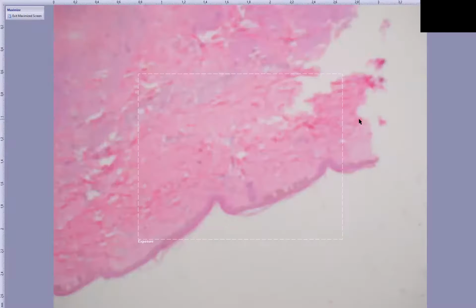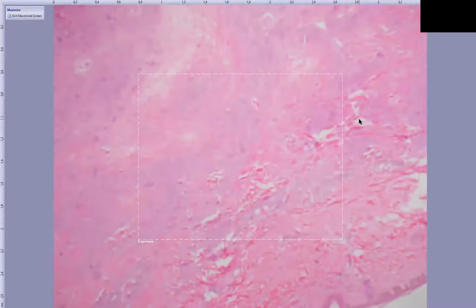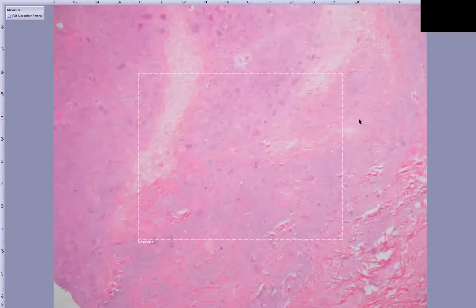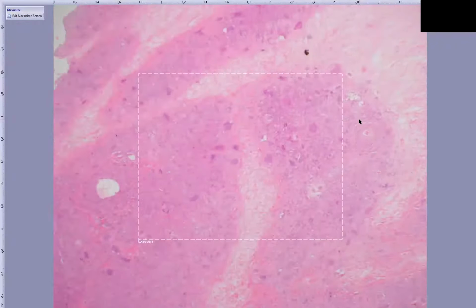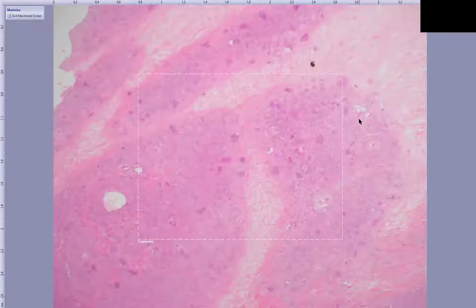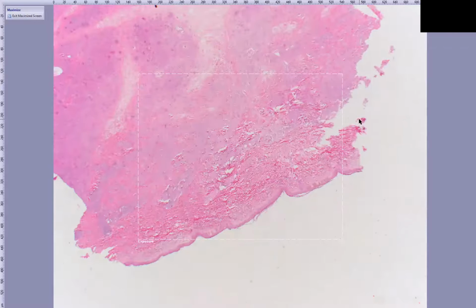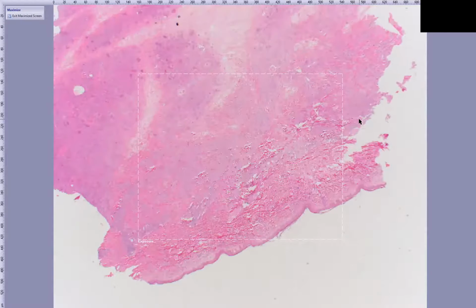Okay, let's contrast that with necrobiotic xanthogranuloma. Now, necrobiotic xanthogranuloma presents as a plaque-like lesion on the affected areas. Usually we see it around the eyelids or the upper torso. So head and neck region, upper torso are common areas, but the lesion morphology is more of a plaque. And so you'll notice that when you look at this on low power, the surface of the epidermis is flat as opposed to the dome-shaped architecture we recognize for juvenile xanthogranuloma.